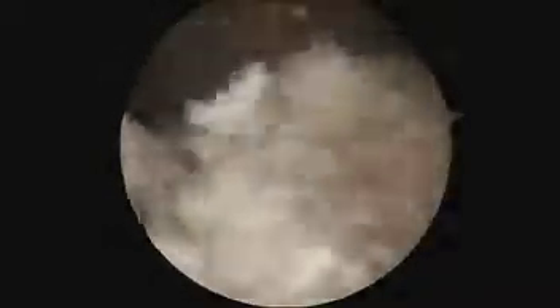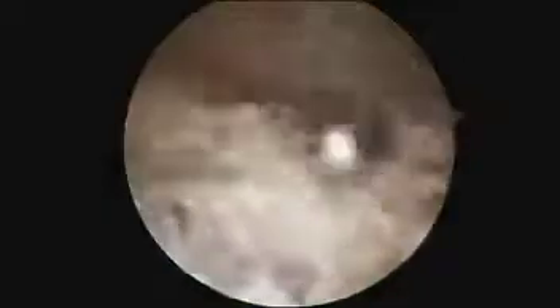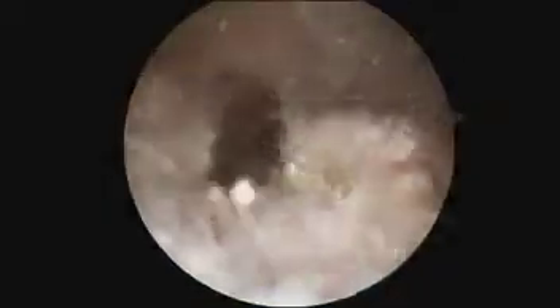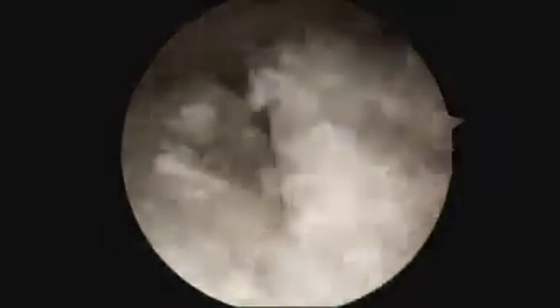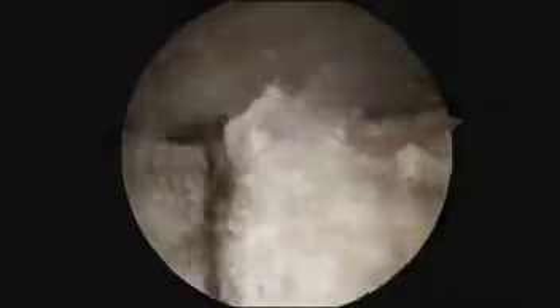After exposure of the tricep tendon, the tendon can be incised longitudinally with a knife through the proximal portal in order to assess the extent of tophus infiltration of the tendon.